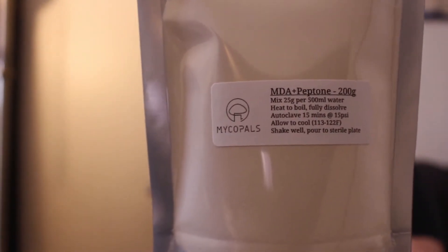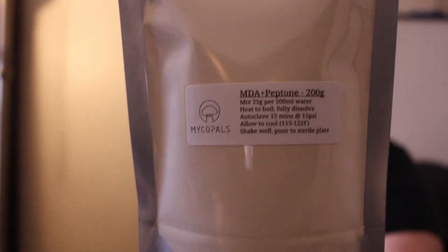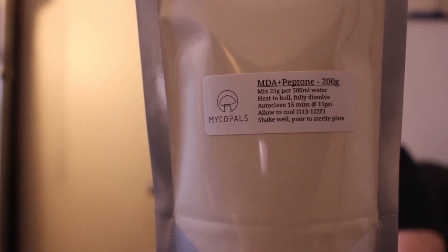Hey, what's up everybody, it's Jordan here with MycoPals. Just coming by today to talk a little bit about this culture media here — malt dextrose agar with peptone. It might be one that you guys have heard about, maybe not, but it's always good to change up your culture media from time to time to help keep your strains going strong.